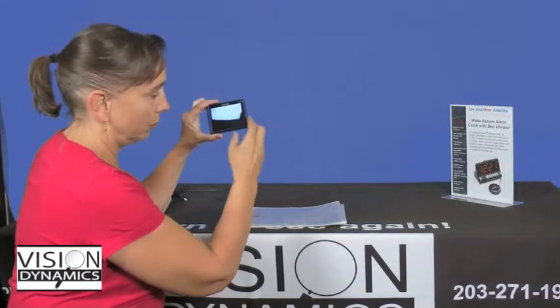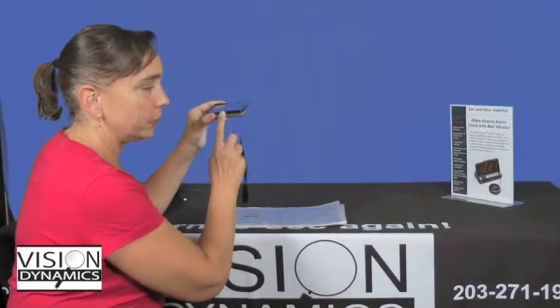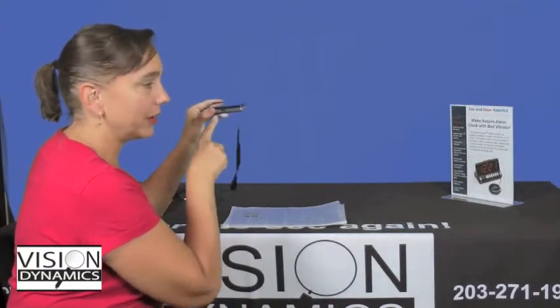And we'll do this again over some print. Pushing it in is going to change your color combinations from black to white, white to black, yellow, blue, all that good stuff. So that button has two functions. Rocking it side to side changes the size of your print, and pressing it in is going to change your color modes.